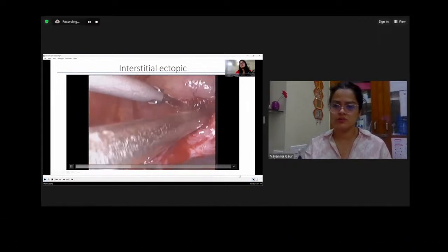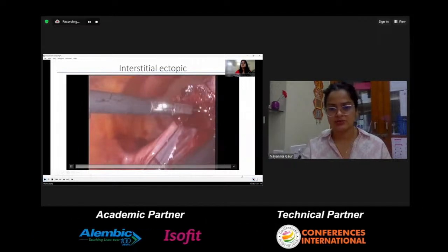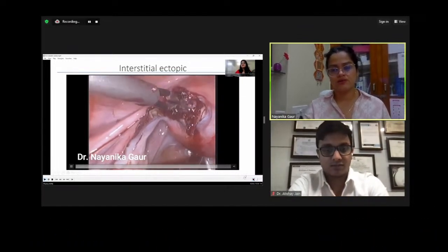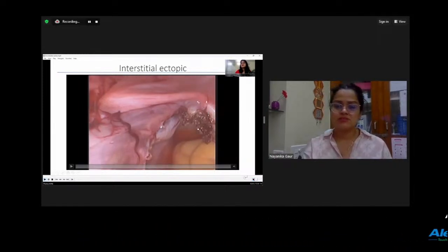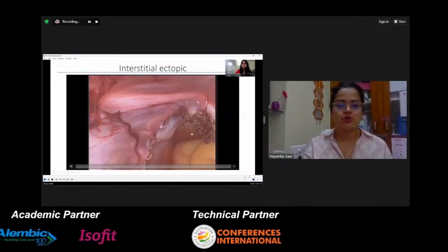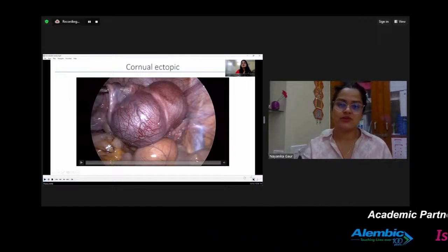So we opened the tube, we suctioned out the products of conception. And after doing that, we also did the salpingectomy for this patient. And then the cornual end was cauterized with bipolar. These patients sometimes do require suturing at this cornual end. However, this patient, since it was technically an interstitial pregnancy, there was no obvious involvement of the myometrium, and therefore cautery was enough.